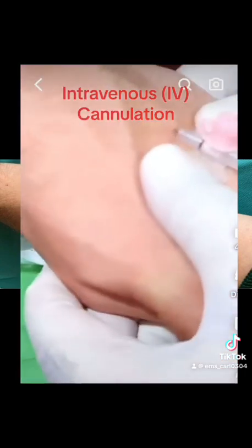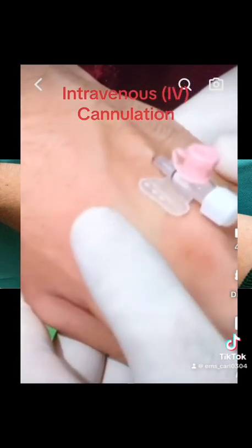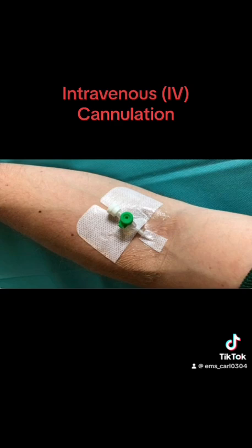Place the needle in a sharps bin and place pressure on the proximal vein close to the top of the cannula. Then place the lock plug on the cannula hub. Step 8. Release the tourniquet, inspect the site for early signs of infiltration, secure the wings with adhesive tape, and flush with saline.